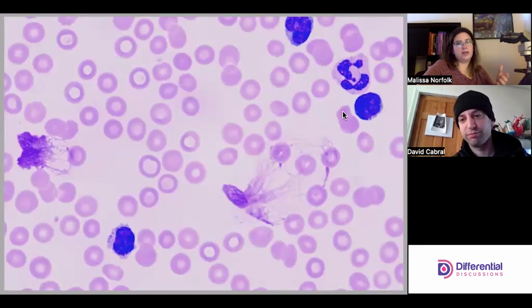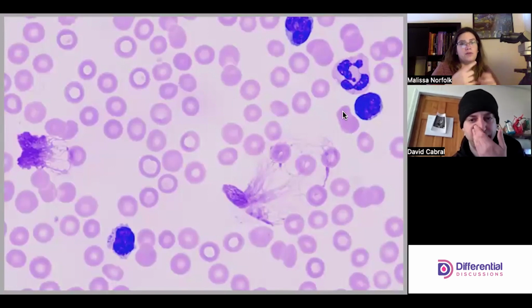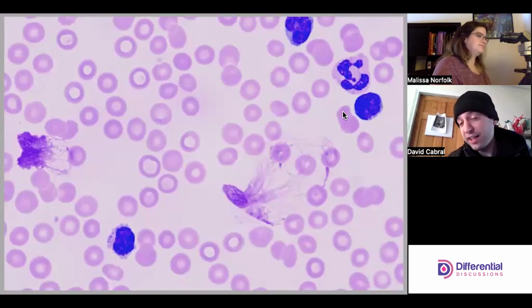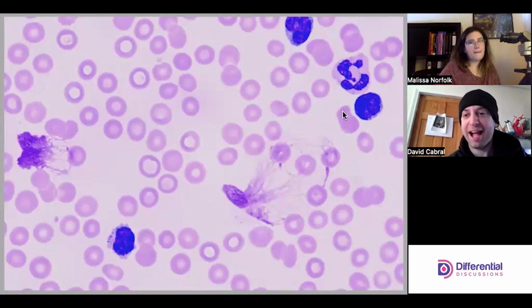Typically, because it's chronic, you're going to find it in adults, not children, right? Remember, babies have a reverse diff where they have more lymphocytes than they do neutrophils, but you would not expect to see that in an adult unless there's a viral infection or CLL. And even then, you're going to see most likely reactive lymphocyte pictures, not these numerous resting lymphs.